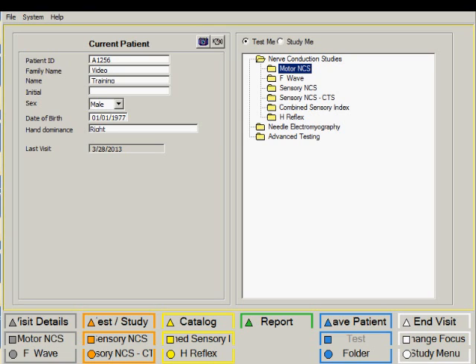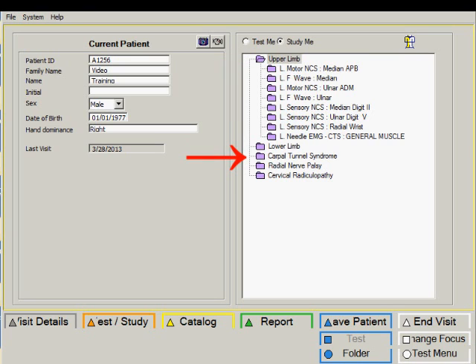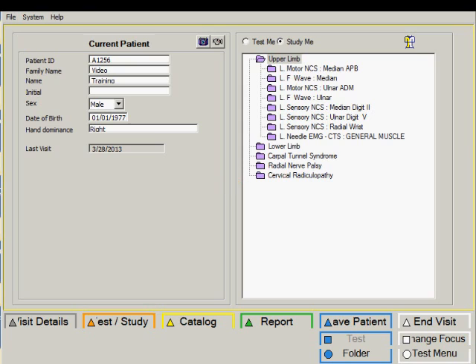The other method is by using the so-called studies and we can display the studies menu by clicking on this button. Right now we have described five different studies: upper limb, lower limb, carpal tunnel syndrome, radial nerve palsy and cervical radiculopathy.